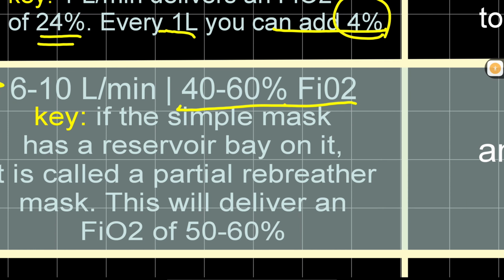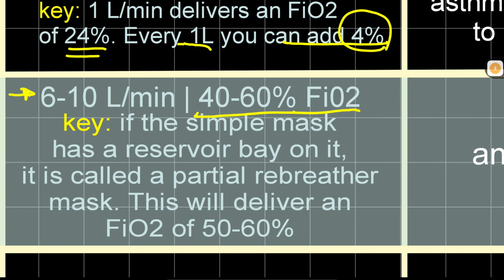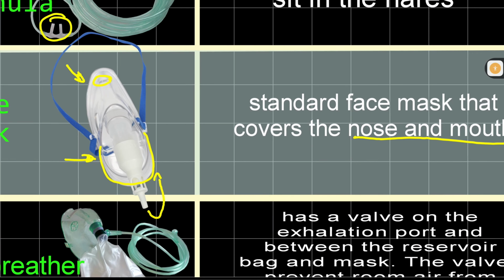Now, there are some key points here, and I want you to focus. If the simple mask has a reservoir attached to it, it is called a partial rebreather mask. This will deliver an FiO2 of 50 to 60%.